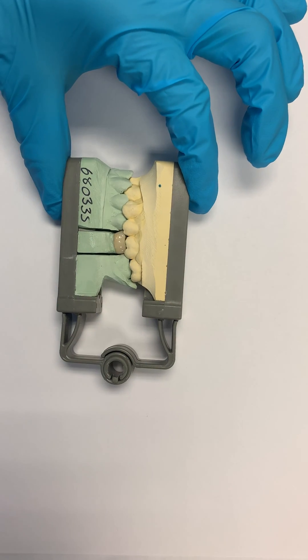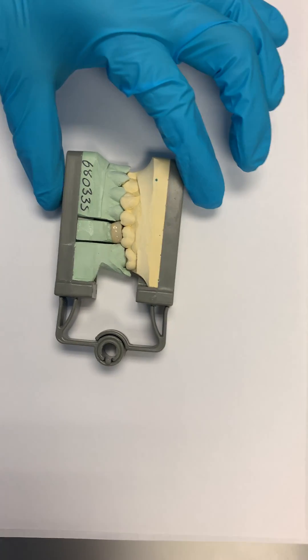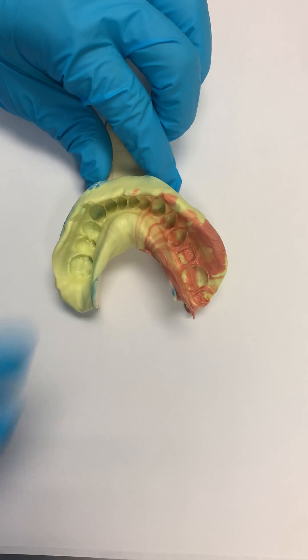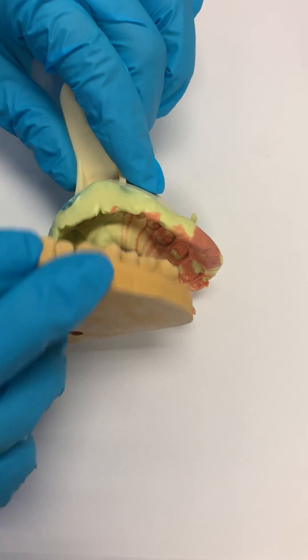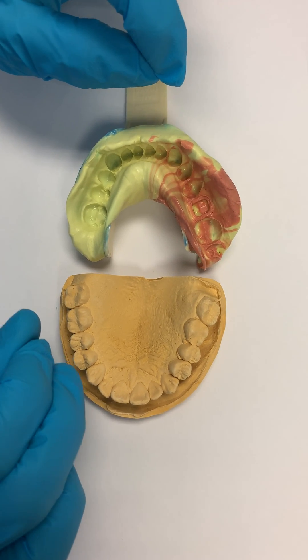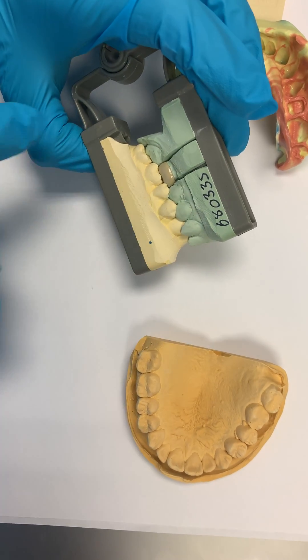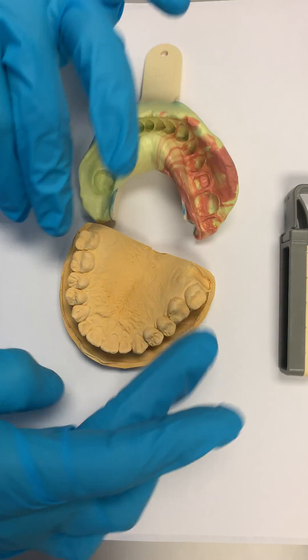A full arch impression utilizes basically the same amount of material as a triple tray. The advantage here is that you have a right and left side, and when you mount it against the upper cast, you have much more stability. The bite will be much better because you have many stops rather than only two or three stops with the triple tray.